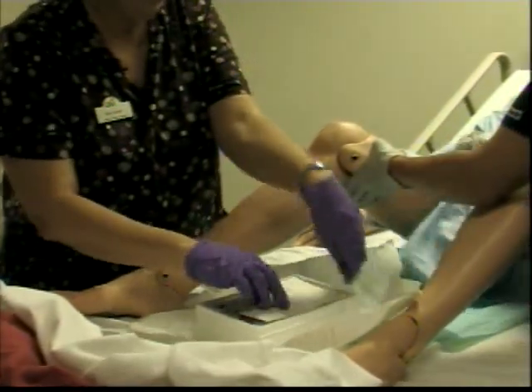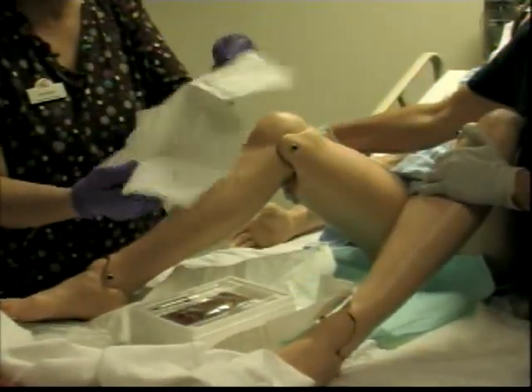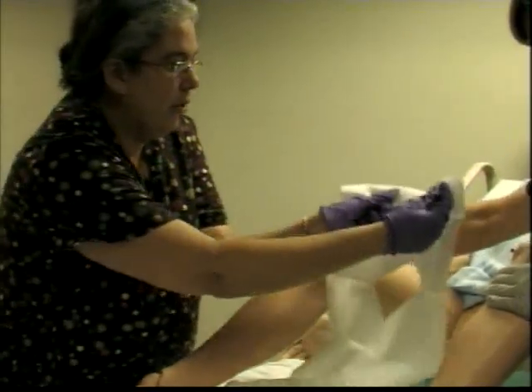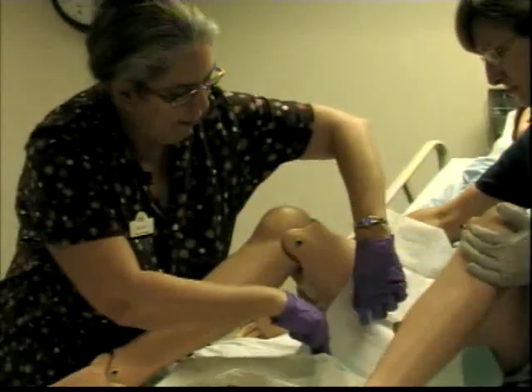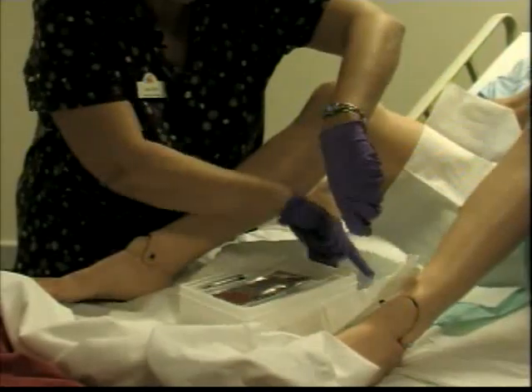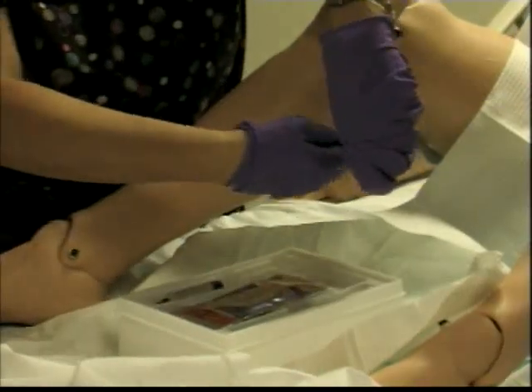"Mrs. Shapiro, I just need to lift up your gown — we're just going to get you cleaned off and get that catheter in." This is the fenestrated drape for the client. There's a little trick to putting it on — grabbing it this way ensures we can cover the area without contaminating your gloves. You're still sterile. The inch border is underneath, maintaining sterility.